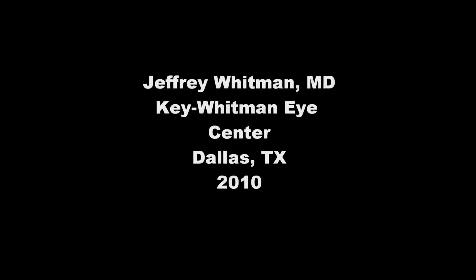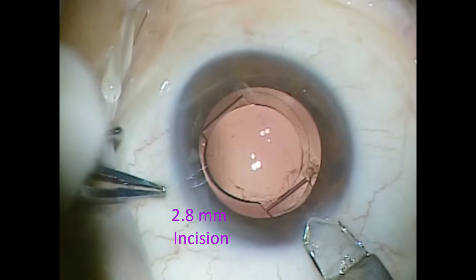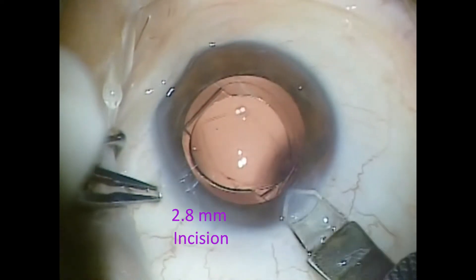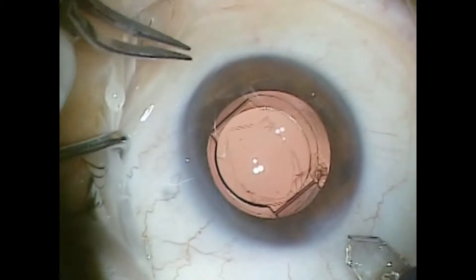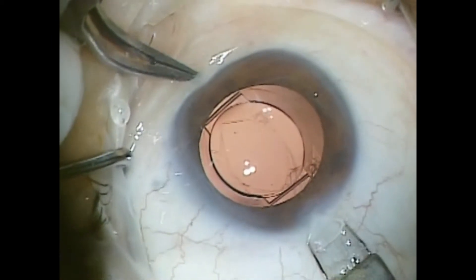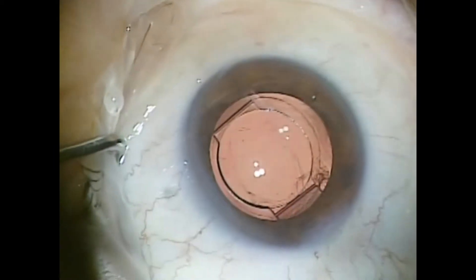This video demonstrates piggyback lens insertion over a Crystal Lens AO lens. First, I'll make an approximately 2.8mm main incision. I try not to overlap the original surgical incision — I find a fresh wound seals better.